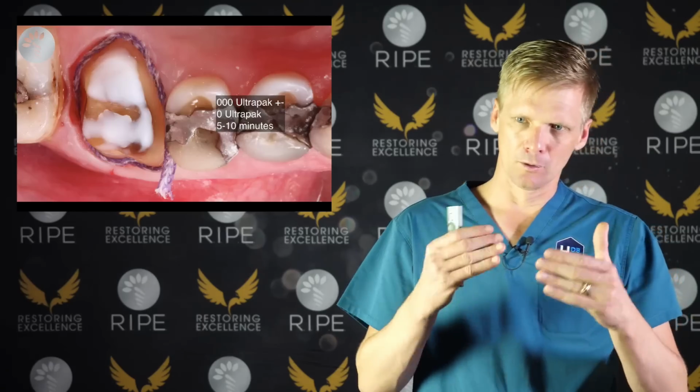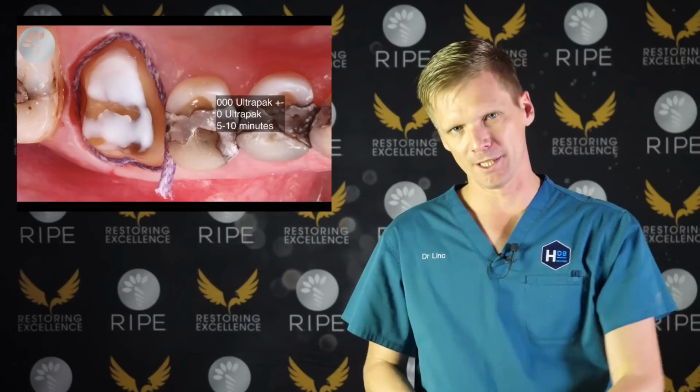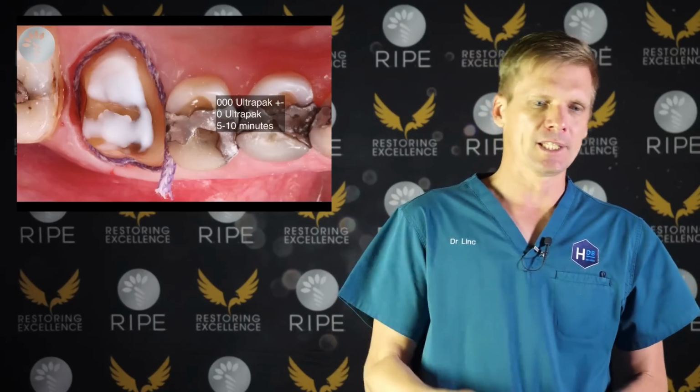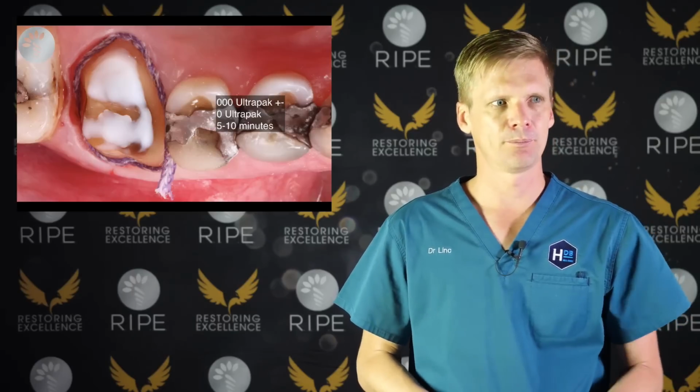If you want both those silicones to be at the same setting amount as they go in and push the light body down into the sulcus. Here are the cords that I use. So this is just an example. It's a prep I did recently.